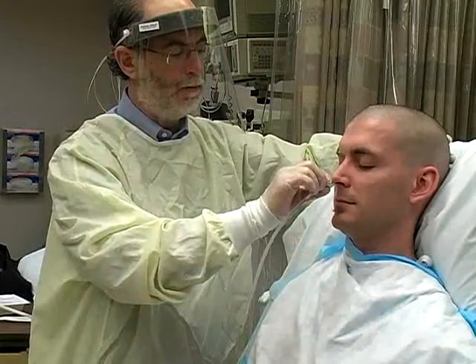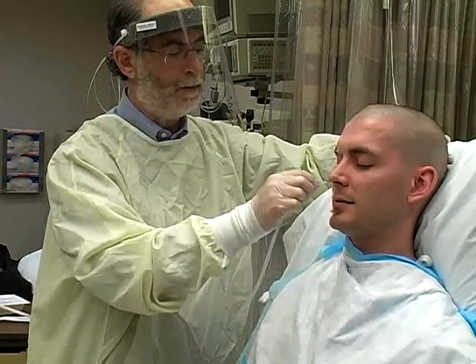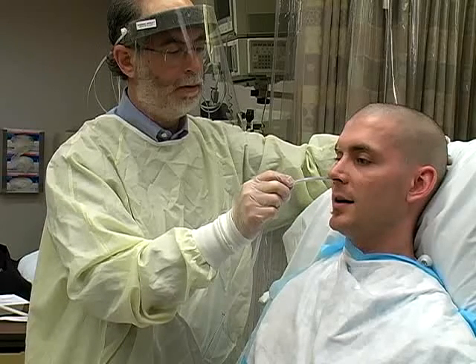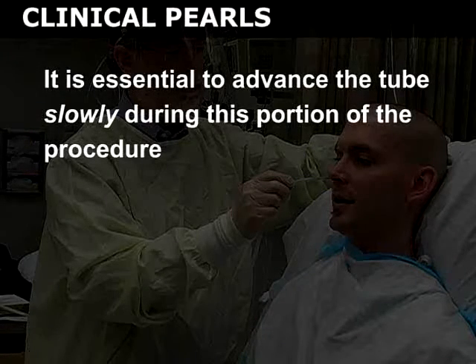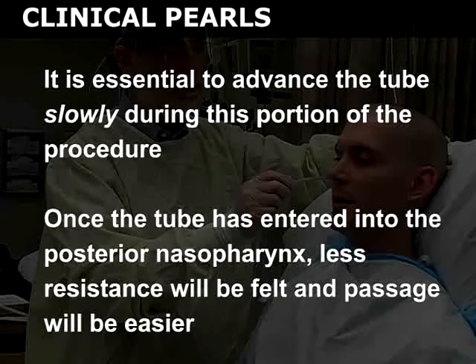Tube insertion through the nasal cavity may be quite uncomfortable despite adequate anesthesia, and you may need to pause during insertion to allow the patient to rest. It is essential to advance the tube slowly during this portion of the procedure. Once the tube has entered into the posterior nasopharynx, less resistance will be felt and passage will be easier.